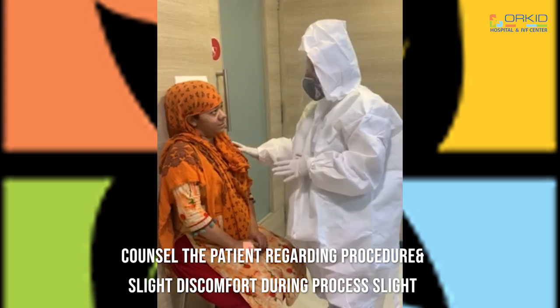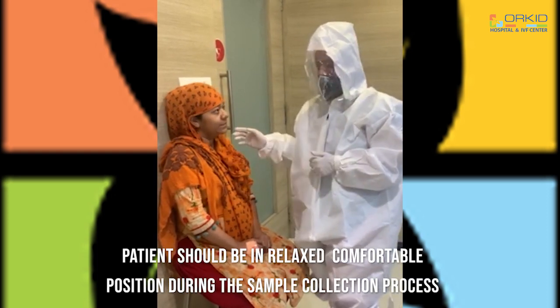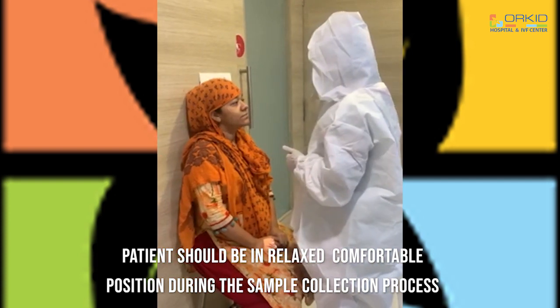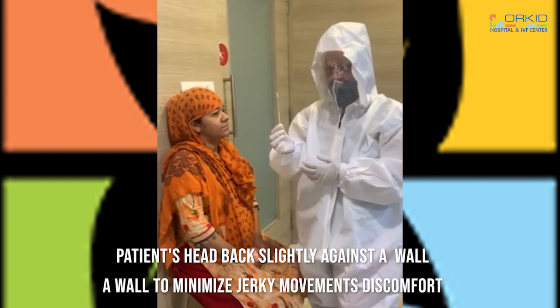This is a swab stick which I am going to use. Place the patient in a comfortable position. The patient's head should touch the back of the wall.